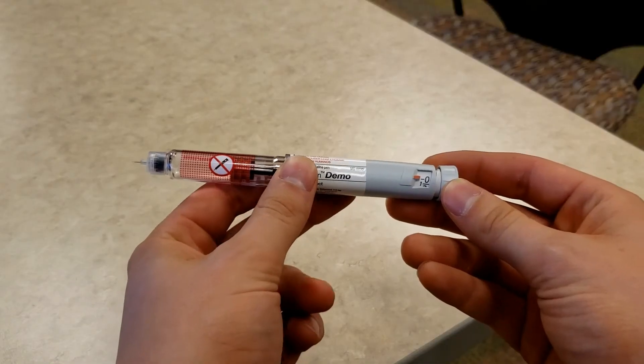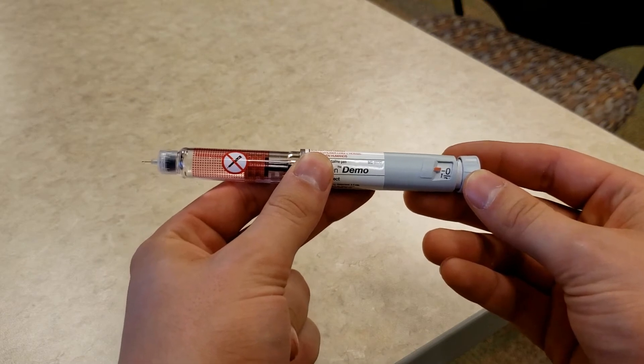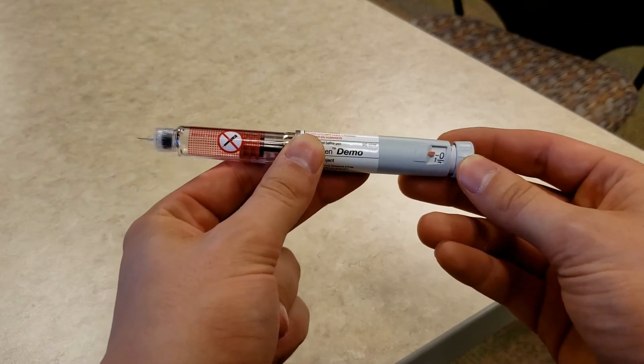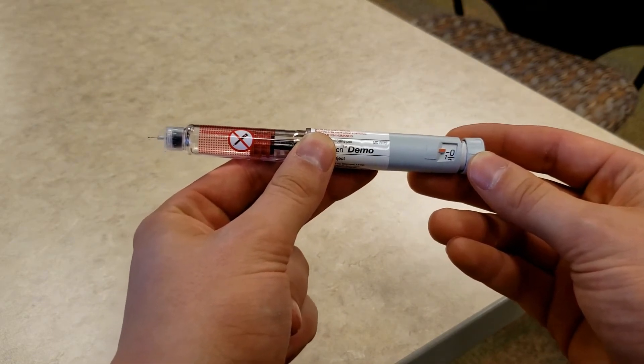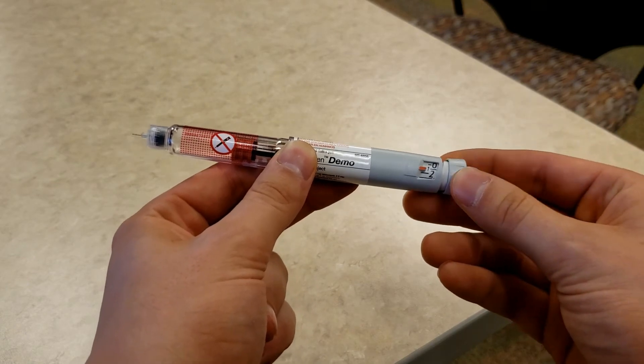The next step is to prime the insulin pen. This is done to ensure that the insulin pen is dispersing the medication properly. To prime the insulin pen, turn the dial at the bottom of the pen to two units and hold the pen so that the needle side is pointing up.